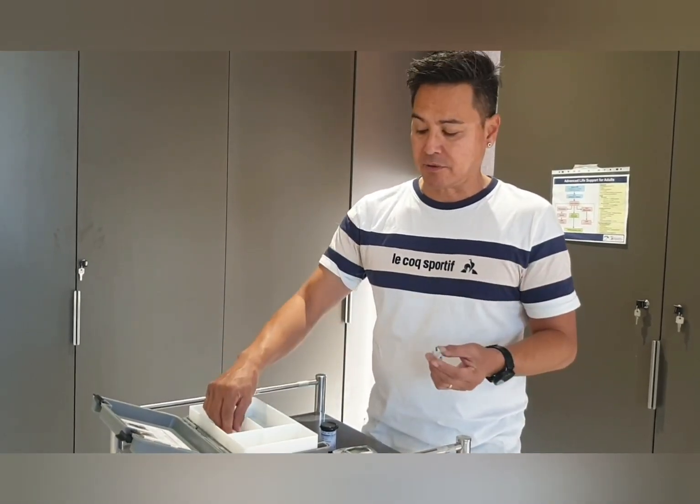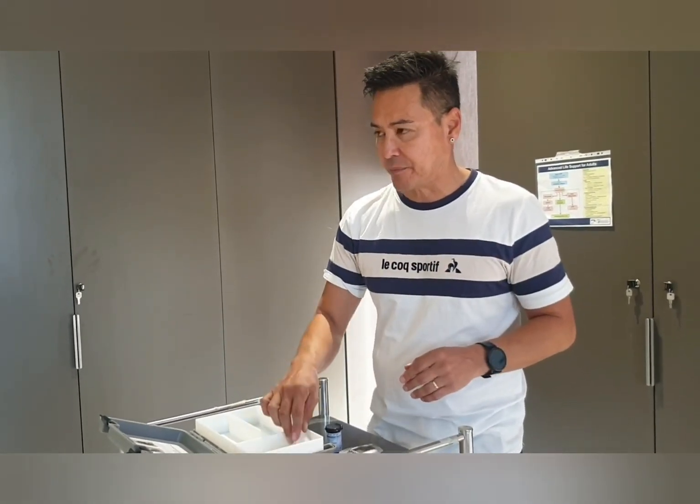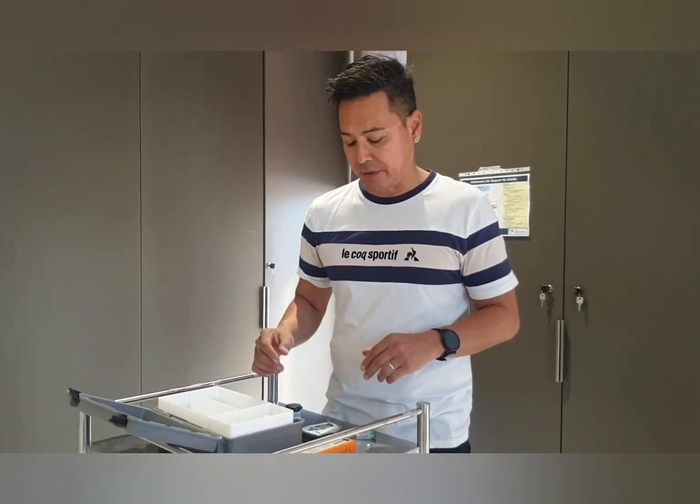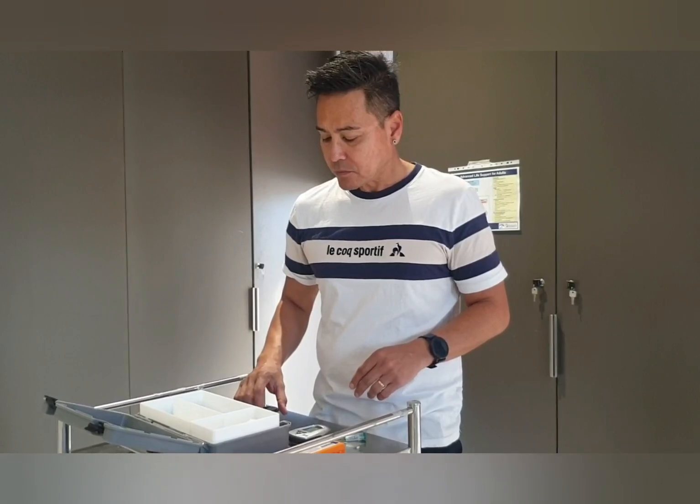I'm going to be using a lancet device — this thing hurts, I hate it. You'll also need a cotton ball. I've taken glucose levels on someone and got a high reading because the patient had eaten a mandarin and had glucose on her fingers. So I recommend wiping their hands with a warm towel — don't clean their hands with alcohol, as that could give you a deranged reading of ketones. Just use a cloth with warm water and clean their hands.